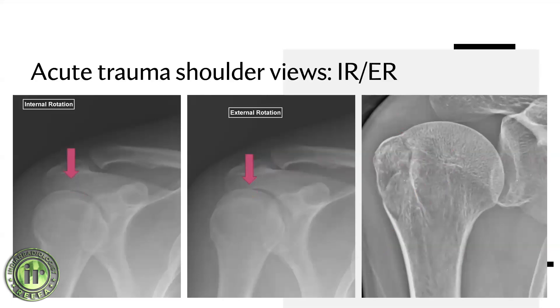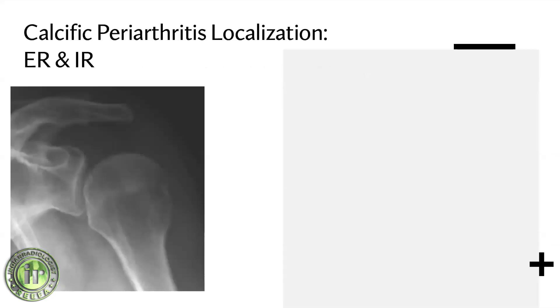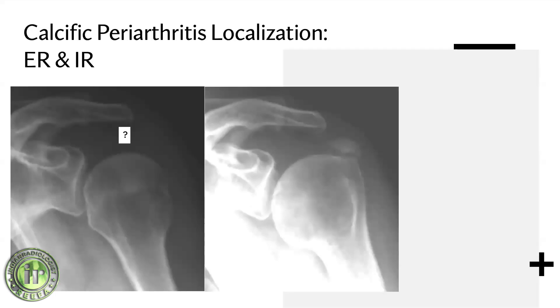Internal and external rotation views are particularly useful for localizing calcifications. Here's a case of acute shoulder pain: the internally rotated view looks completely normal, but the externally rotated view shows the greater tuberosity coming out with a calcification clearly visible. Because the calcification is not seen on internally rotated views but is seen on externally rotated views, this is classic for supraspinatus calcific tendinosis.